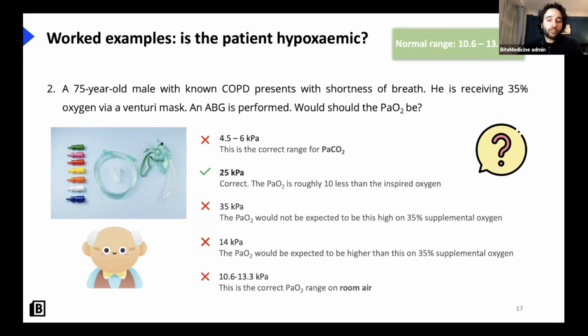And it's important not to over-oxygenate in certain conditions such as COPD. That's why Venturi is so brilliant, because you can just look at the side of these colors here and you can see the percentage of oxygen you're delivering and how many liters of oxygen you can deliver through that device as well. So, a bit of background and making sure that you've all understood this concept, which can be quite difficult to understand, but hopefully I've made things nice and simple for everyone.